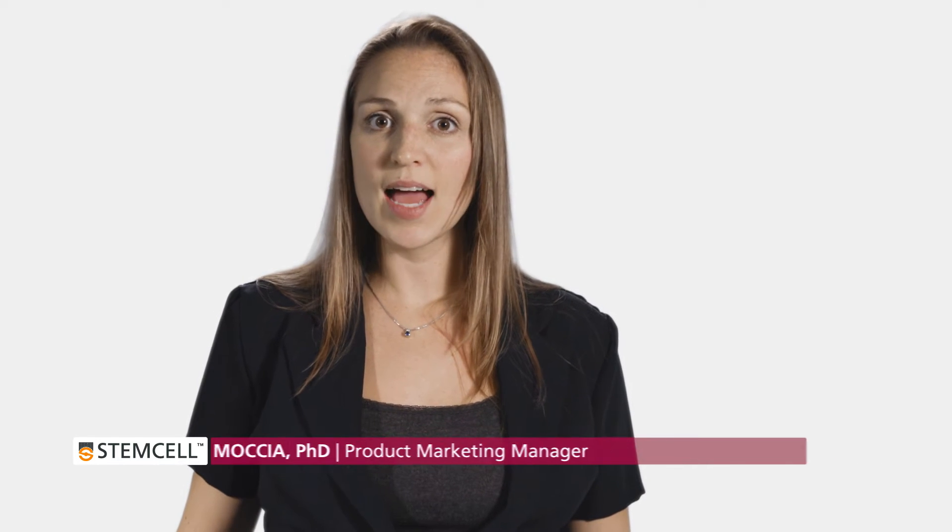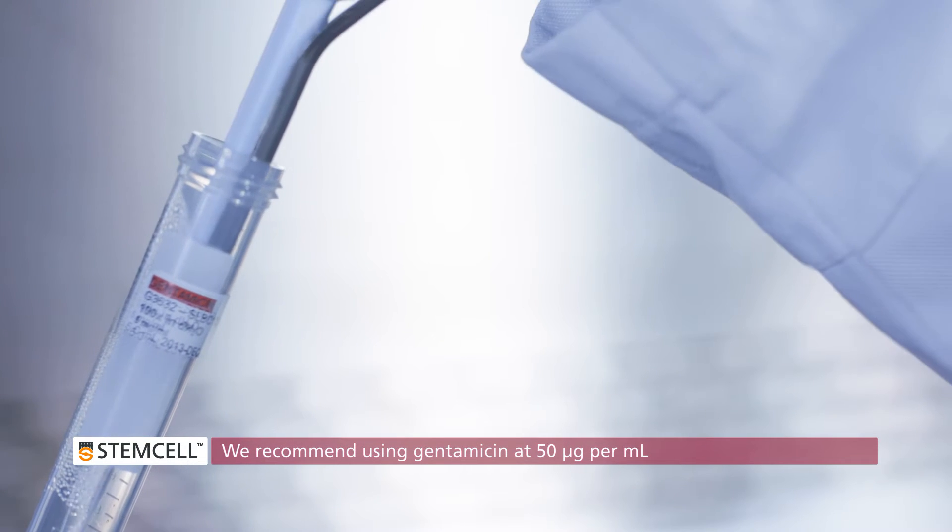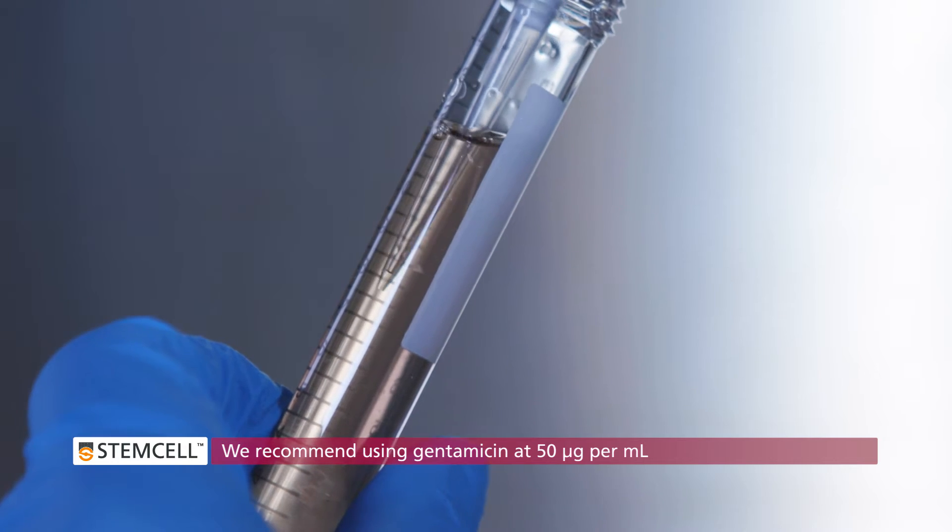Intesticult organoid growth medium does not contain any antibiotics. You'll need to add your desired antibiotics before using the medium in your experiment. We recommend using gentamicin at 50 micrograms per milliliter.